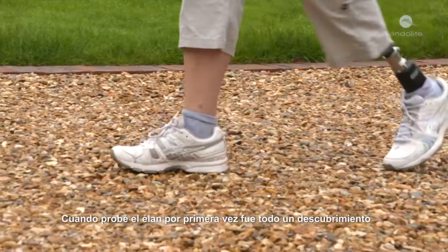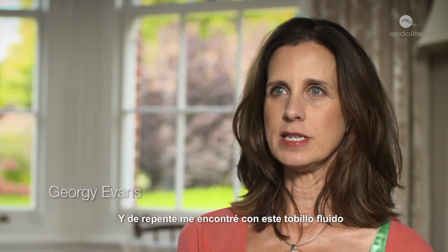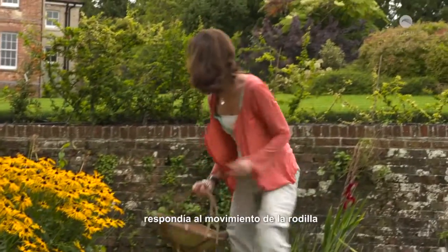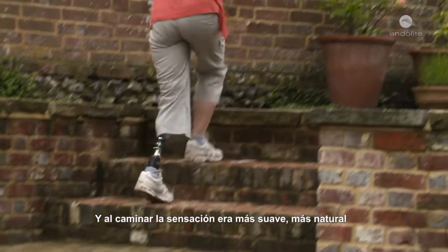When I tried the Elan for the first time, it was really a revelation because I'm used to rigid ankles and suddenly there was this fluid ankle. I could move my knee and then the ankle would respond to my knee moving. I would walk and it was a much softer, more natural feeling.